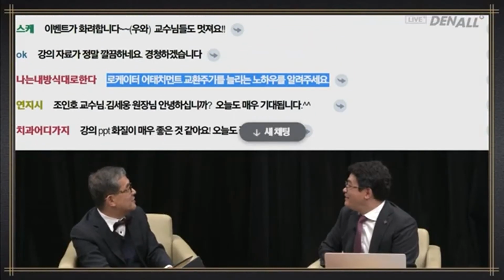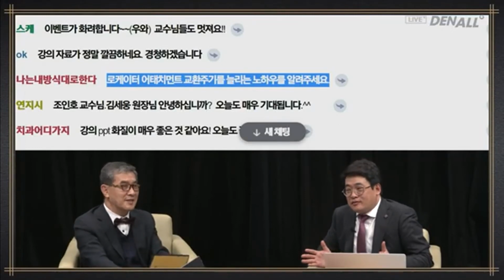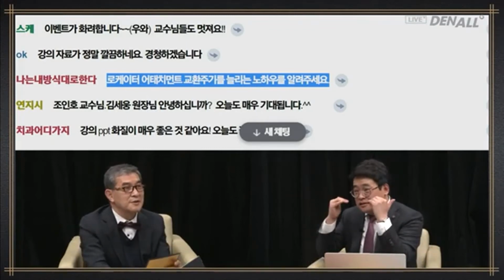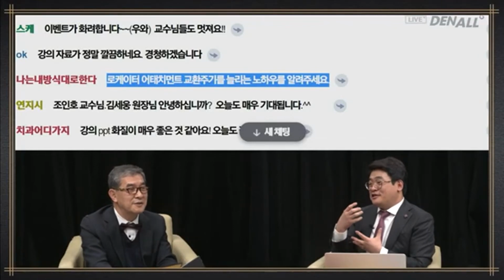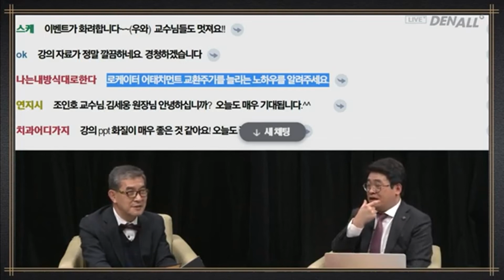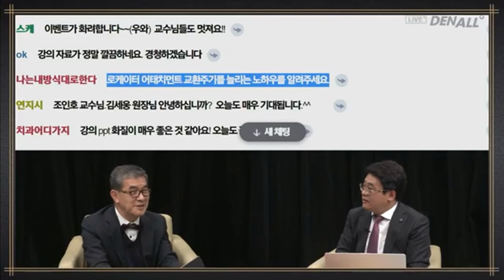How can I extend the cycle of replacing locator attachments? I think the person is asking how I can use the nylon part long. When the patient puts on a denture, they should use their hands and put it in. That is ideal. However, most patients put it in like this, especially female patients. They put it in and they bite it and they put it in, and this can lead to deformation. Maybe they're not as good with their hands.